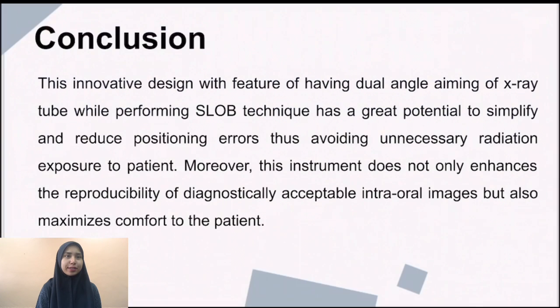To conclude, this innovative design with the feature of dual angle aiming of the X-ray tube while performing the SLOB technique has great potential to simplify and reduce positioning errors, thus avoiding unnecessary radiation exposure to the patient. Moreover, this instrument not only enhances the reproducibility of diagnostically acceptable intraoral images, but also maximizes comfort to the patient.